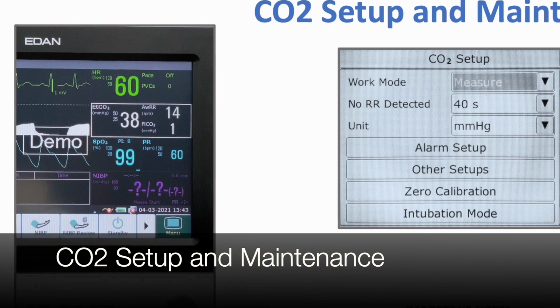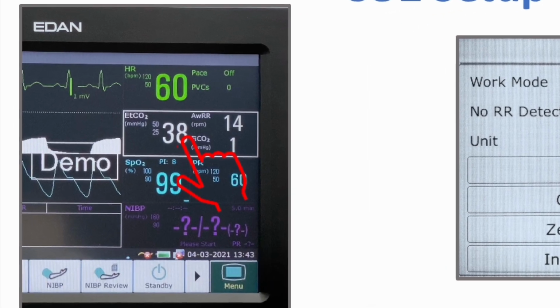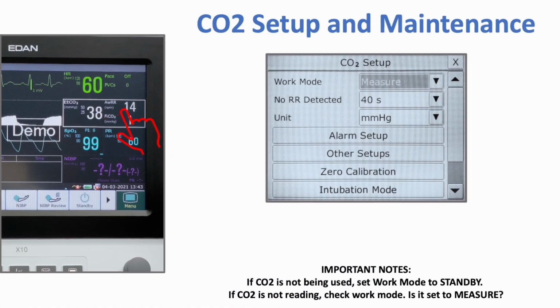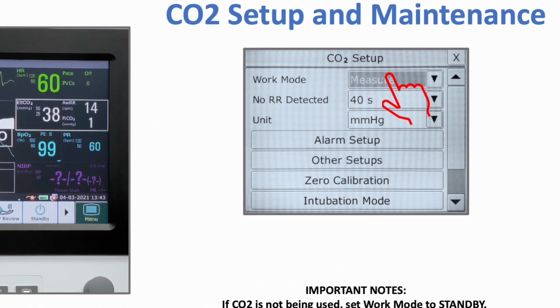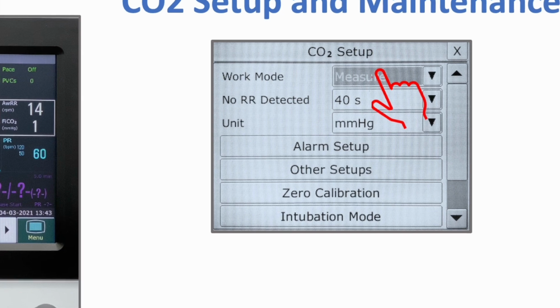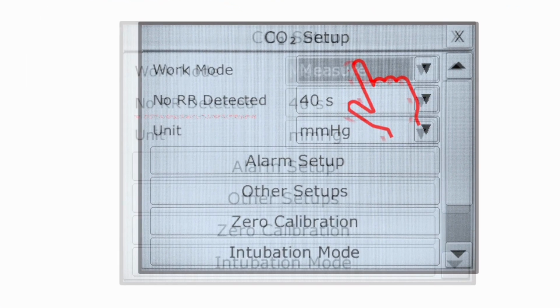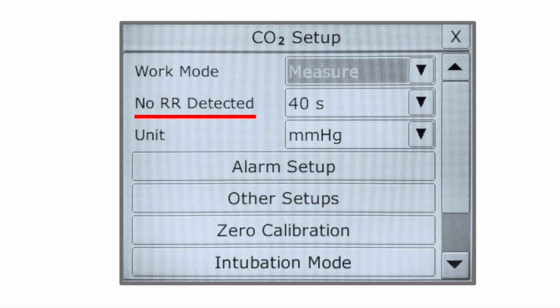CO2 Setup and Maintenance. Touch the CO2 parameter tile to enter CO2 Setup. Work mode should be measure unless CO2 is not being used. If CO2 will not be used, set work mode to standby. The setting below work mode is apnea alarm on the IM series or no RR detected on the X series. This can be set as high as 40 seconds. This is considered a high priority alarm and cannot be disabled.